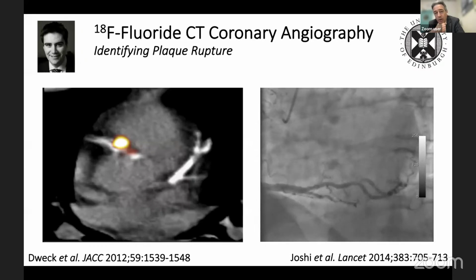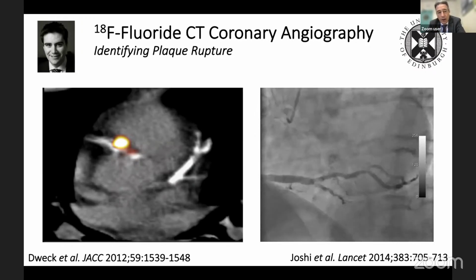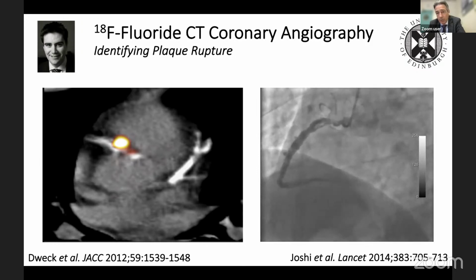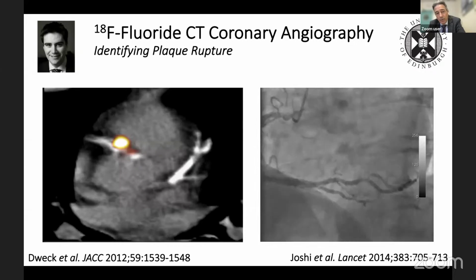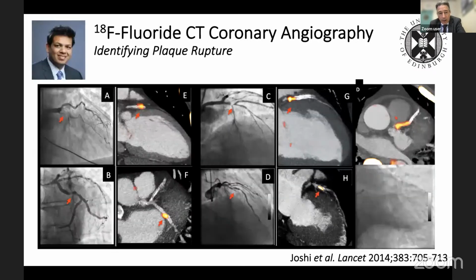And what you can see on the right-hand side of that CT image is the heavily calcified left anterior descending coronary artery. And then on the left-hand side, you can see the right coronary artery in that proximal segment, just where that clot is, a very high uptake of sodium fluoride, suggesting that this might be a marker of a culprit plaque. Nick Joshi, who did his PhD with Mark and me, went on to study many patients, over 80 patients with coronary disease, 40 of whom had an acute MI, 40 with stable disease. And you can see that we were able to identify the culprit plaque in the vast majority of these patients. Time and again, we could see the sodium fluoride lighting up in areas of plaque rupture, the culprit territory of the myocardial infarction.